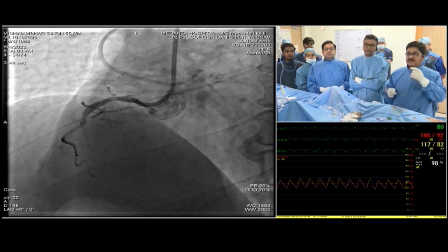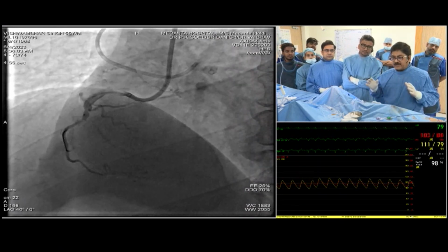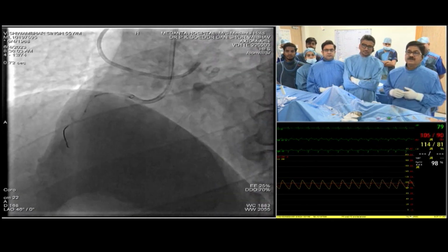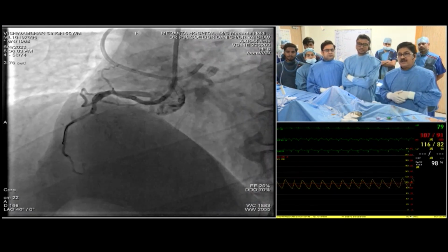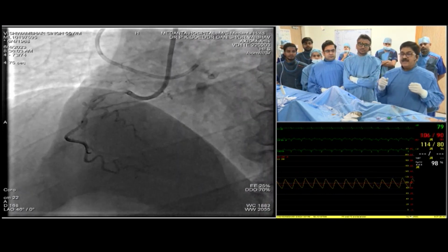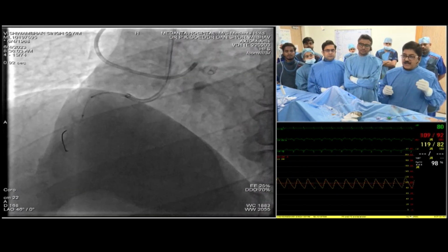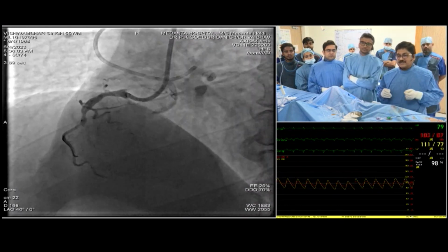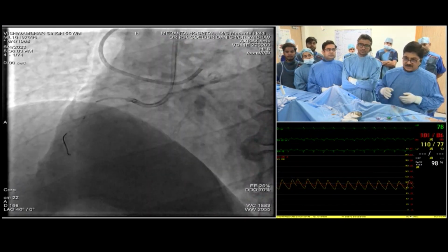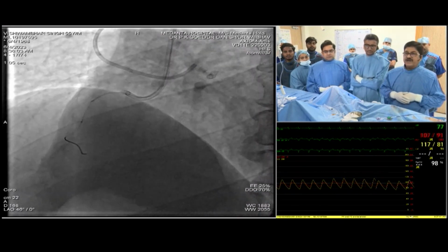In such a situation, one option is a tip injection using a microcatheter. Tip injection using a microcatheter can give us big information in such a situation. Yeah. Actually, the tip injection is a double-edged sword. It can tell you that there is a microchannel, but if you are not in a microchannel and you are subintimal, you can produce a dissection, and then something that you could enter much more easily would become more difficult. So I personally do not advocate that, although rarely I have done it, but very rare.